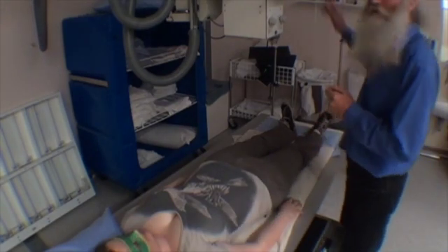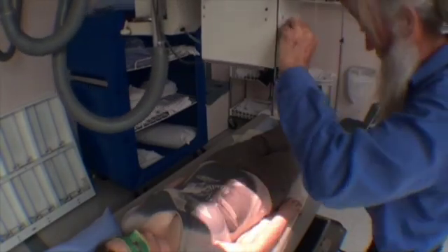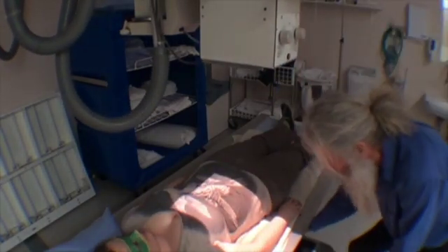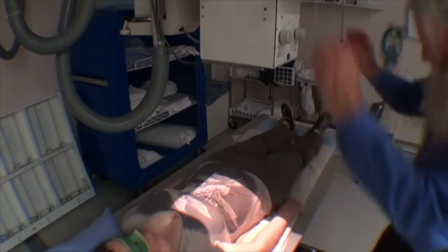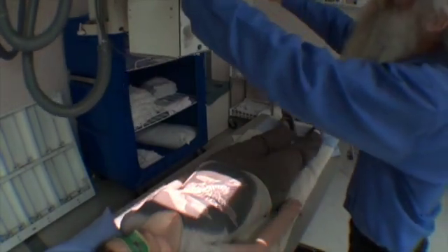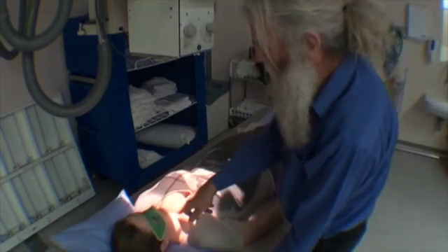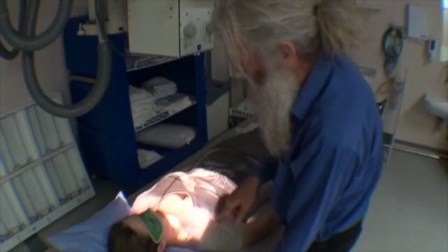Now we're going to do a thoracic spine series lying on the table. The first thing I want to do is work out where my x-rays are going to go. I open up wide, I move my cassette, set it to the cassette, collimation top and bottom. I go into the middle of the field here, locks in position there. I move my patient around so I can make sure that I get the top of the thoracic spine on my film.